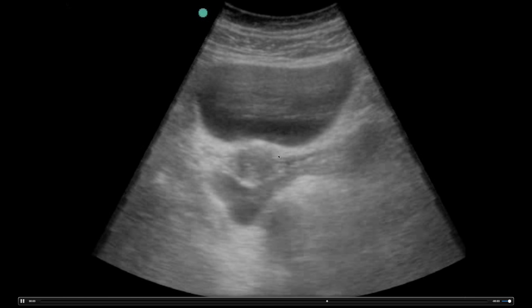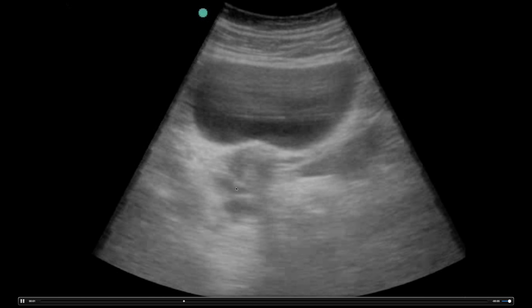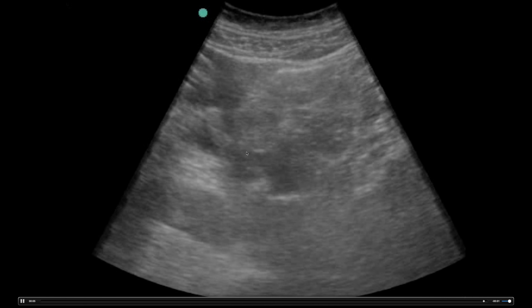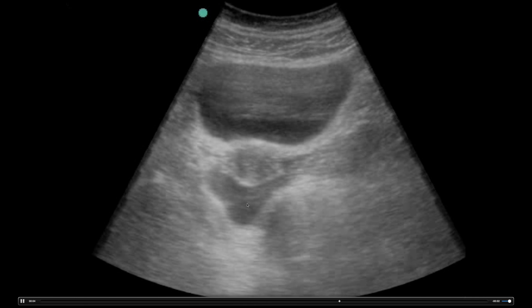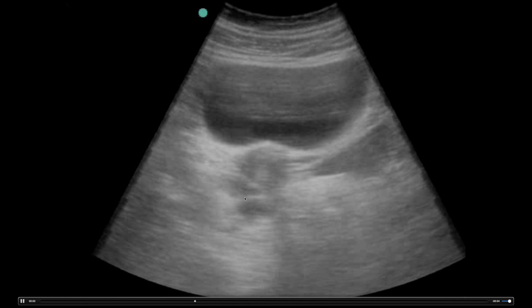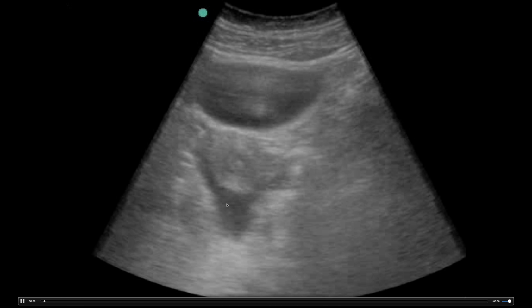Likewise, here's another patient. Here's a transverse view of the bladder. Here's what's likely the prostate here. Could be the uterus if you looked in longitudinal, but regardless, you have fluid here posterior to that. You notice how, again, fluid's going to be dependent and sharp and angulated. Looks like triangular back here. So that's in the pouch of Douglas area.